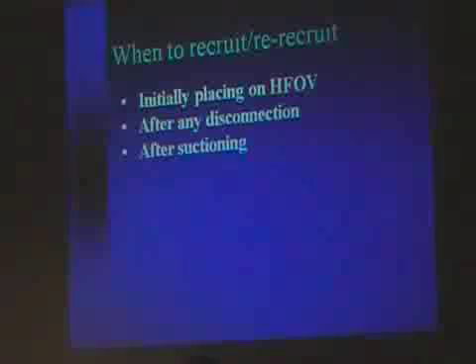But when you're first putting a baby on, and that's why we've been talking about how important it is that we be at the bedside, so we can sit down and do this. We can slowly go up, slowly come down, and find that place where the FiO2 is at a minimum, and that is critical, particularly after surfactant, or a baby that you're just putting on. Maybe he's got some other problem, maybe pulmonary hypoplasia, whatever. That is number one time when this needs to be done.